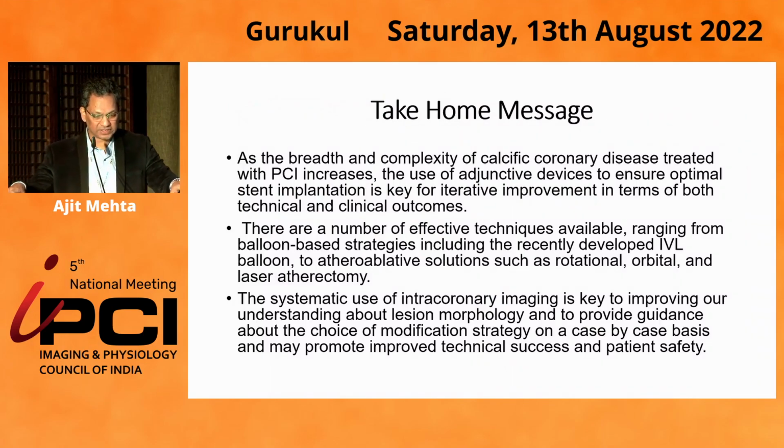So the take-home message: the complexity of calcific coronary disease treated with PCI is increasing. The use of adjunctive devices to ensure optimal stent implantation is the key for improvement in both short-term and long-term outcome in these patients.